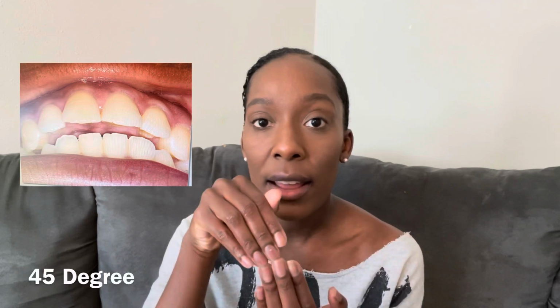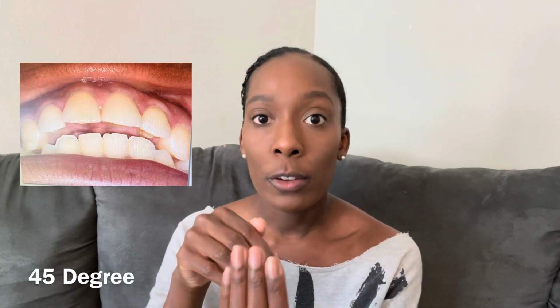The second image that is taken is called the 45-degree image. And in this image, you want the patient tilted chin up, and we are looking at the patient's bite and seeing how deep the bite is. So with some patients, their upper and lower teeth are sitting neck and neck. Sometimes you have the upper teeth way over. Sometimes you have the upper teeth way back and the lower teeth are way forward. In this image, you can see exactly how deep the bite is and how far the upper teeth are or how far the lower teeth are.